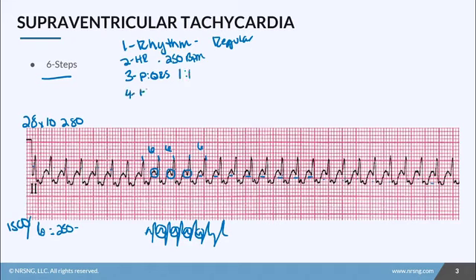Step number four, let's do the PR interval. Counting from here to here, we have about two boxes, so that would be 0.08 seconds. Remember, the normal PR interval for sinus rhythm is 0.12 to 0.20 seconds. But when your heart is beating so fast at 250 beats per minute, it takes less time from the P wave to the QRS — from the atria to the ventricles — so the PR interval is usually shorter.